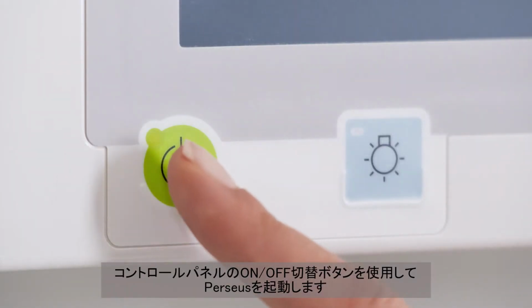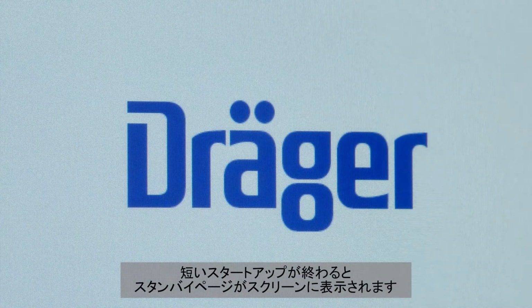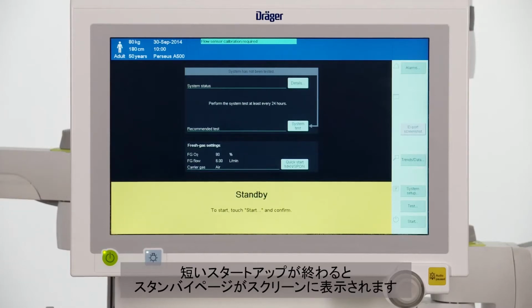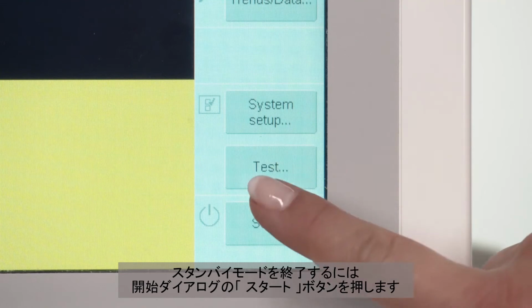The on and off button on the control panel is used for starting the Perseus. After a short startup phase, you will see the standby page on the display. To leave the standby mode, press the Start button in the Start dialog.